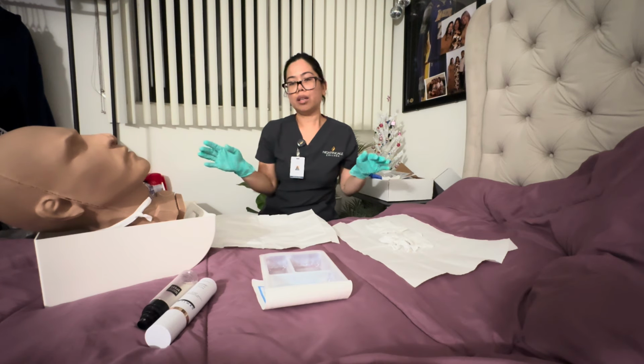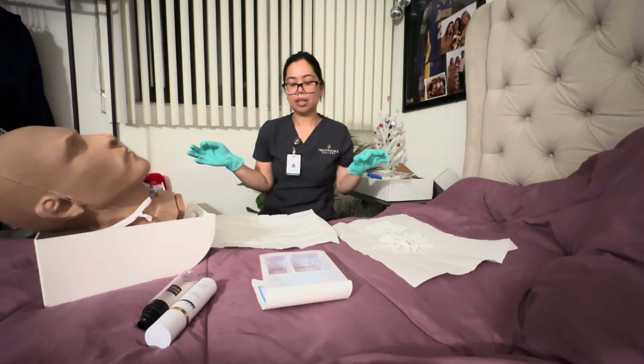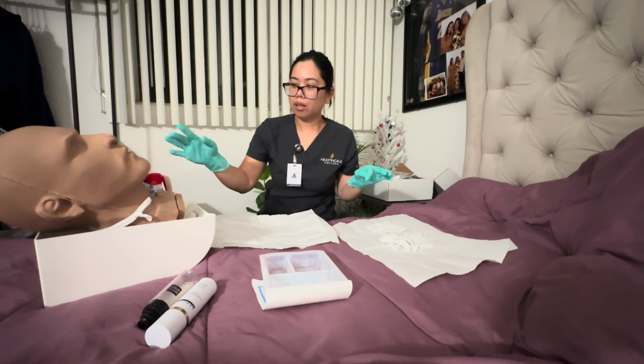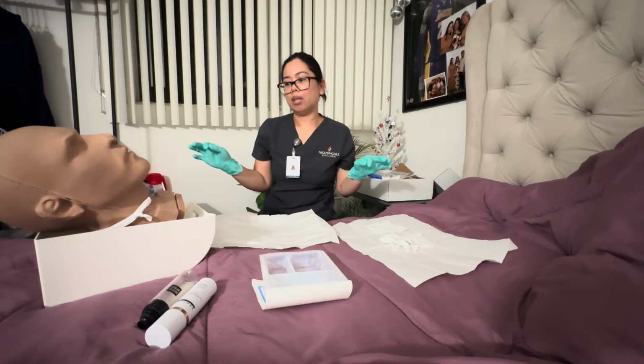Okay, so we want the area to be pat dry so that the patient won't have any skin irritation if it's still damp and a little wet, and it can also cause bacterial infection.